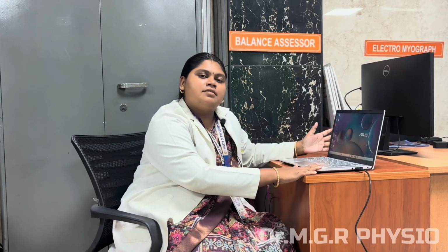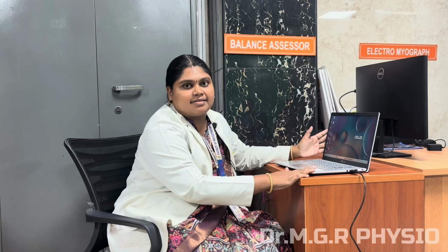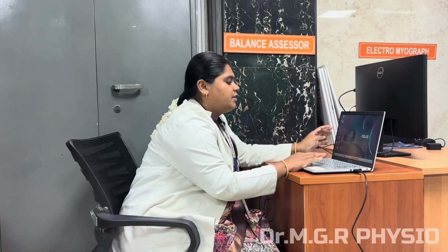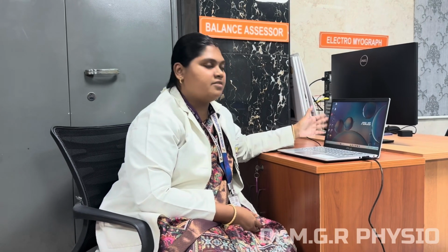We purchased this particular equipment around 2022. It cost around 7 lakhs. So today we'll go through the mechanism, how it works, and how we use it for rehabilitation purposes. We use this balance assessor for many conditions where balance is lacking, whether it is a musculoskeletal balance loss or a neurological balance loss. Proprioception can be assessed, and vestibular function can be assessed with this device.